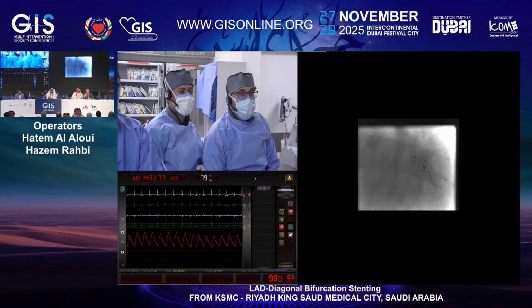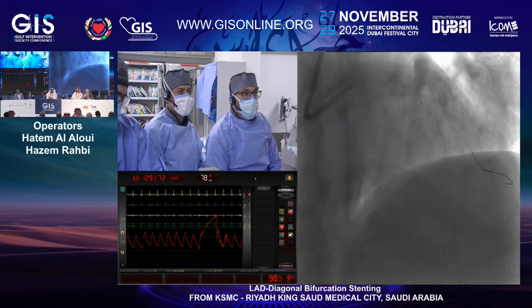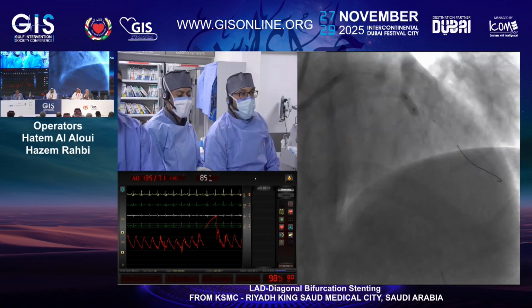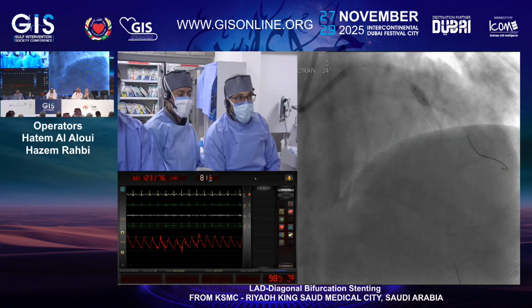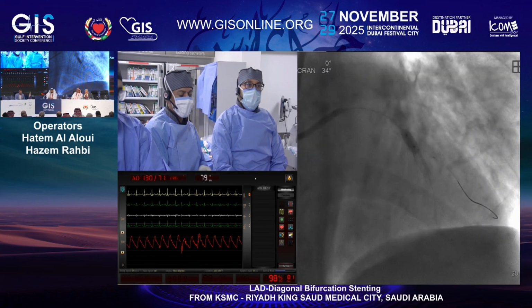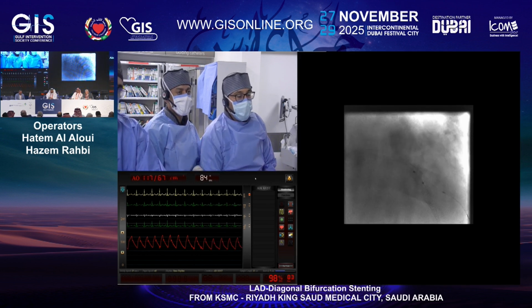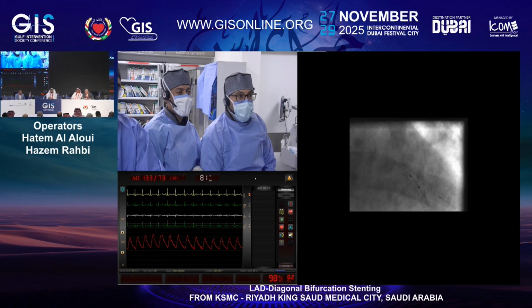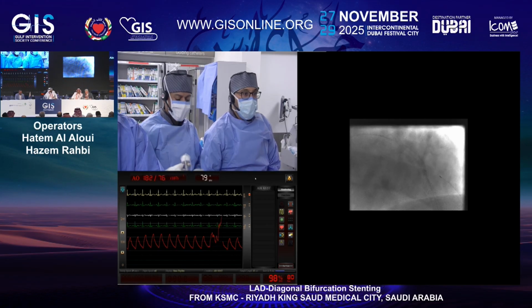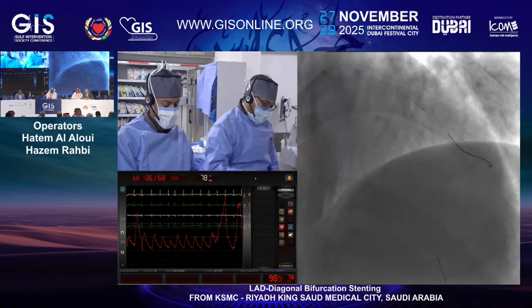Distally, go up. I think we are fine. It's very appropriate. Good position immediately before the proximal arm of the bifurcation. You see the shoulder of the balloon. It's a bit long, but it's not protruding in the distal part. Boost again, please. Let's see if we have missed the proximal strut or not. That's fine. Can you have the boost on the screen? Looks fine. We'll take a 3.5 NC balloon to post dilate distally.